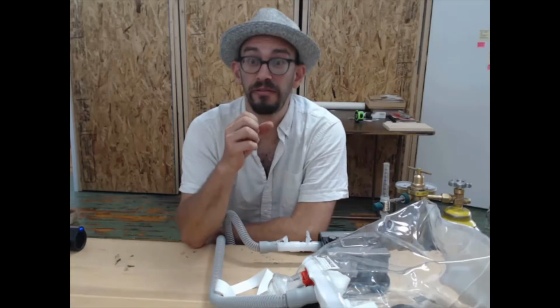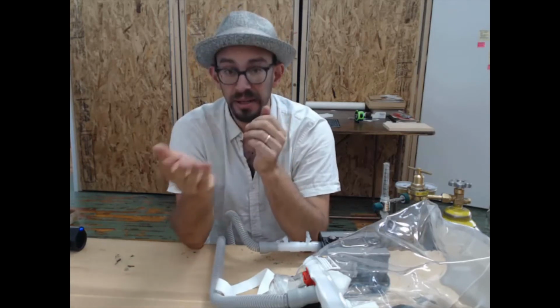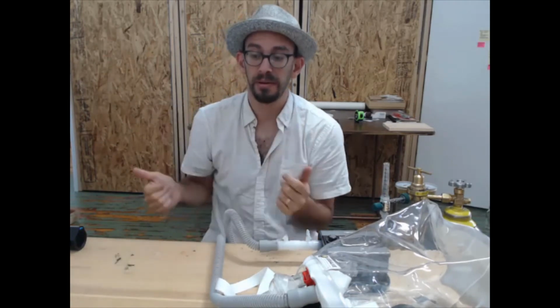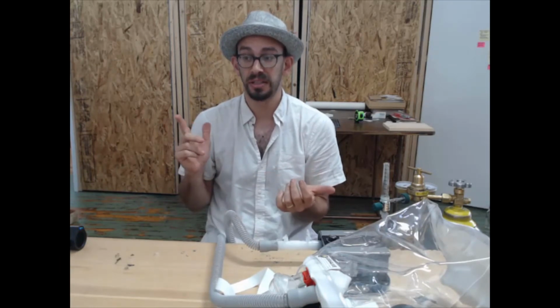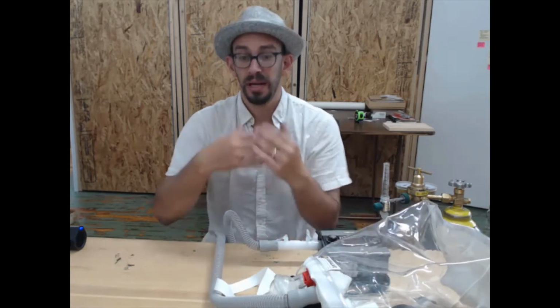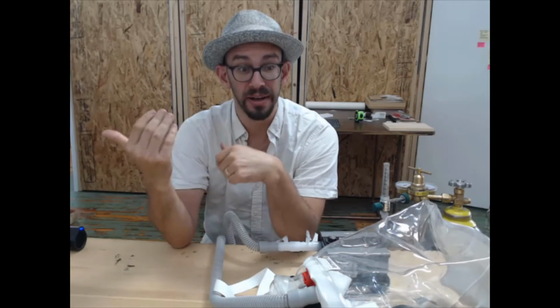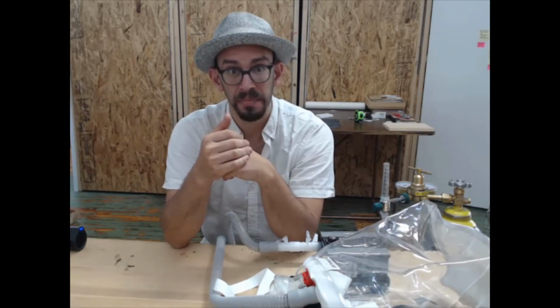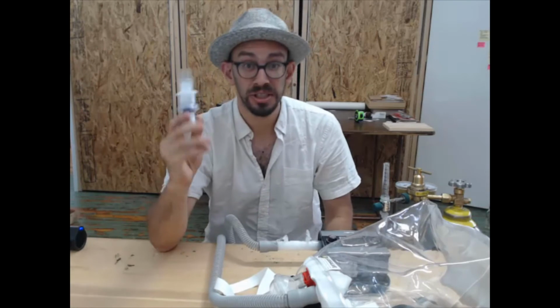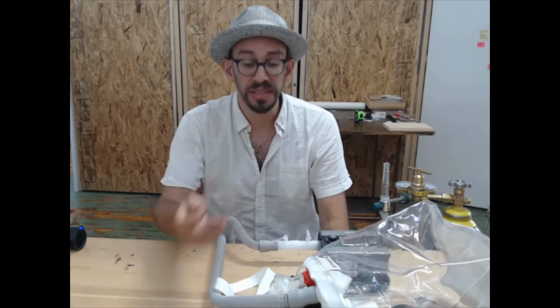Set it aside. Talking with physicians who are using oxygen treatment hoods to treat COVID patients, they are almost entirely working in pressure regions less than 10 centimeters of water pressure. This is talking to doctors in Lombardy who use these. This is talking to doctors at the University of Chicago who are running a phase 1 clinical trial on these treatments for COVID. All these doctors are finding this is a low pressure treatment where you titrate the FiO2 to ensure your patient is saturated. So, for starters, be in the habit of ensuring the PEEP valve is not connected unless you or the attending physician is absolutely certain that you need higher pressure for this patient.